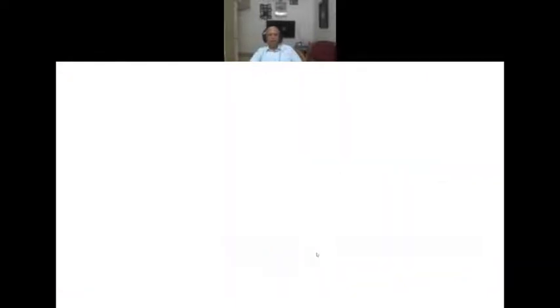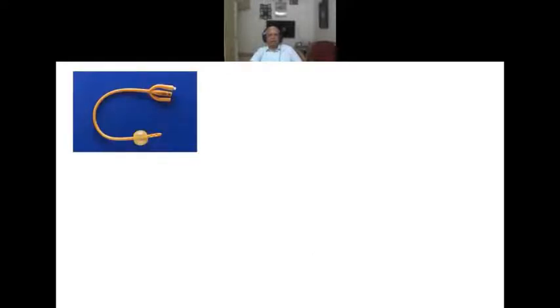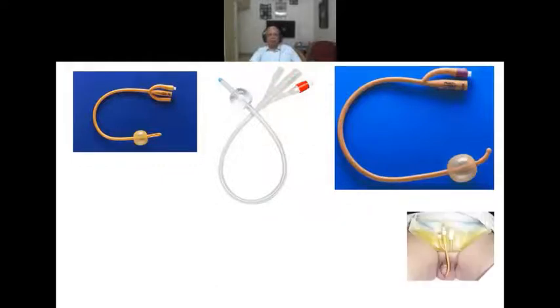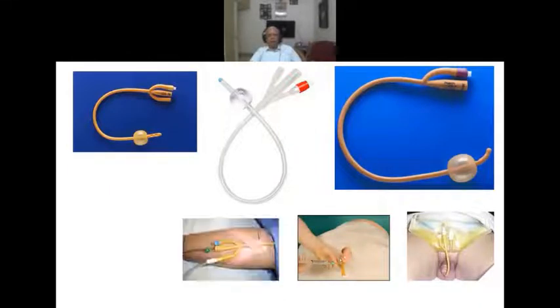After completion of the resection, I have to put this catheter. This is a three-way Foley catheter. You can see there are three ways compared to the two-way Foley catheter. And this is what my friend said, the silastic catheter, for long you can keep it in. Once the catheter is fixed like this, then you inflate the balloon with 40 ml. This is the strapping that is done. You stretch the catheter nicely and strap it to the thigh, because this traction prevents further bleeding.